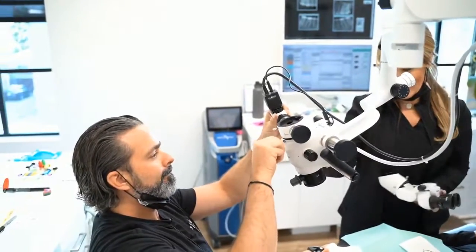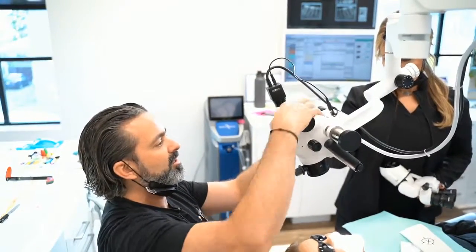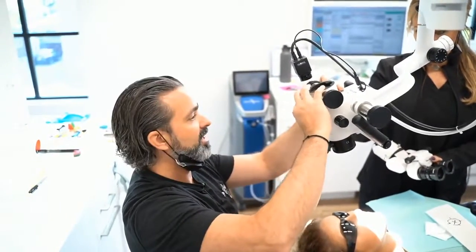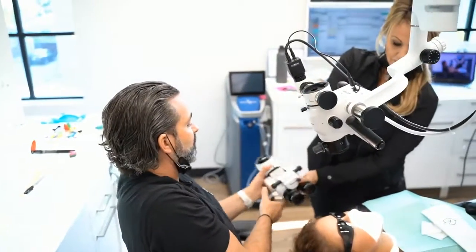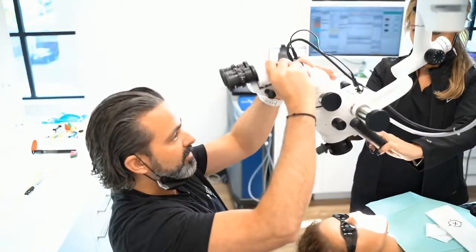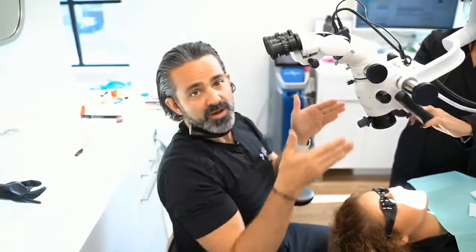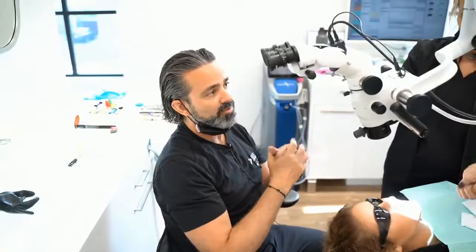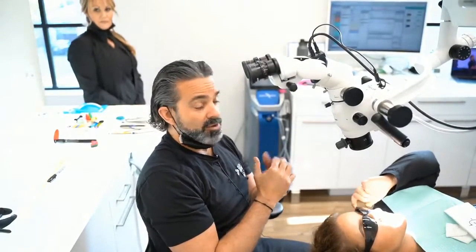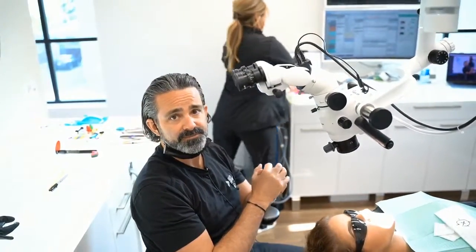I guess that's the other thing. When you look at microscopes, these little tweaks that I'm talking about and why you stack and what your agenda really is are why working with the microscope is really important. I needed what I wanted out of the deal, and so Seiler really fit the bill on what was important for me. So yeah, that's my sales pitch for Seiler, I guess.